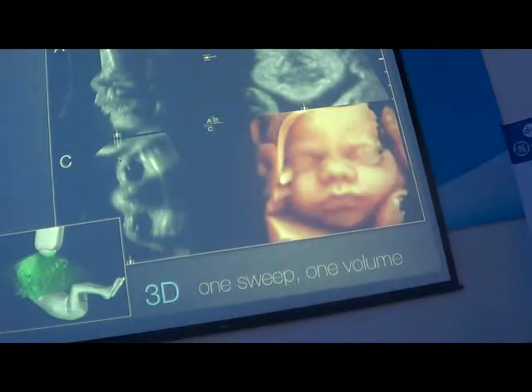And you can also do a 3D rendering with the surface mode of all the external part of the fetus. Và chúng ta có thể sử dụng các công nghệ dựng hình ảnh rendering để đạt được hiệu quả lớn nhất như về phần mặt và các phần ngoài của thai như là tay và chân. But you need amniotic fluid in front of the face. Tuy nhiên điều quan trọng nhất là phải có dịch ối.